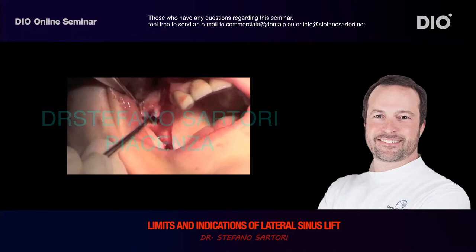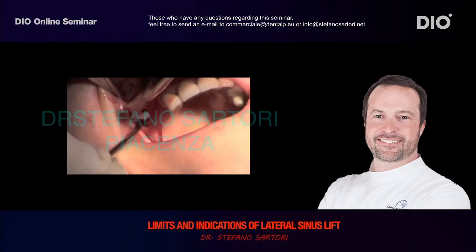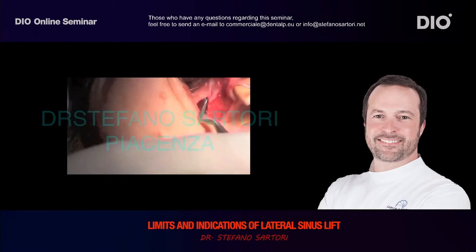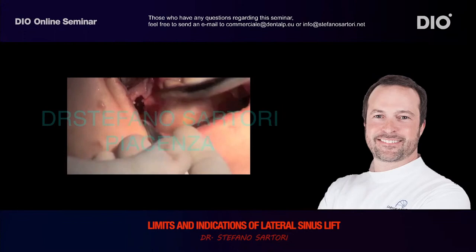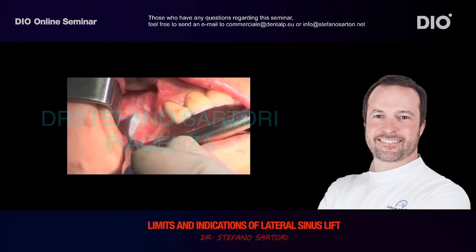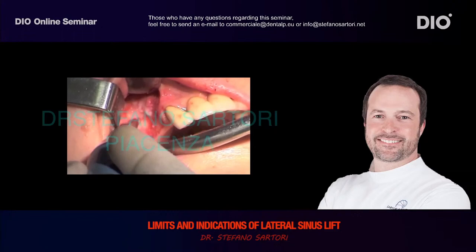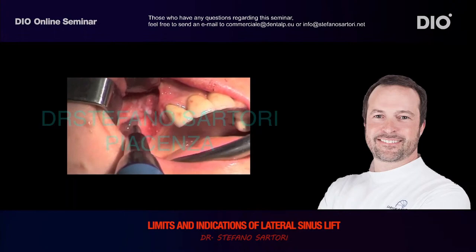In this video, you can see the debridement. The debridement is very important. It's the key to success of the procedure. The debridement should be performed both with manual instruments, the first step, and then with the piezo surgery instrument. The debridement in these cases takes 40 minutes, not less than 40 minutes. You have to remove all the old biomaterial. And with the piezo surgery, you can use a lot of saline solution to wash the cavity and make it easier to remove the biomaterial.